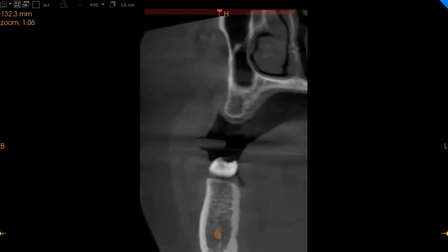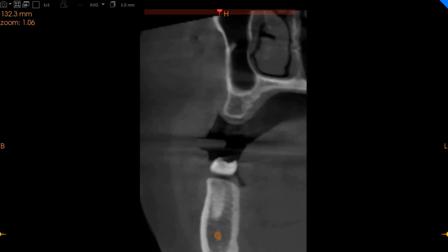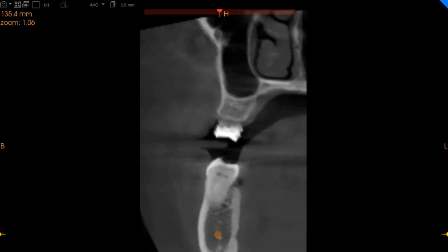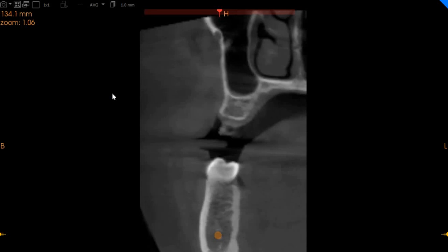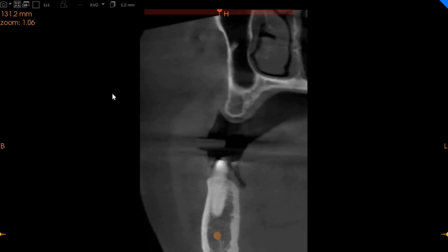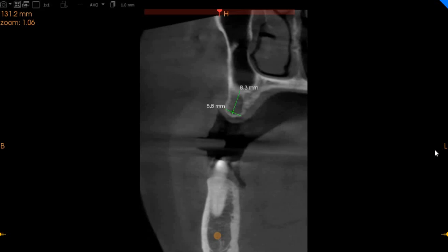We're going to go slightly distal when replacing the second premolar. Here you can very clearly see that the bone dips a little, so there is a possibility of a sinus lift in this region. We've got five millimeters of width with approximately eight millimeters of height.